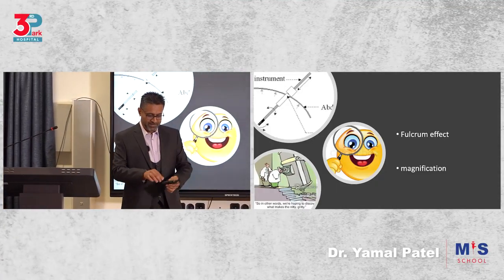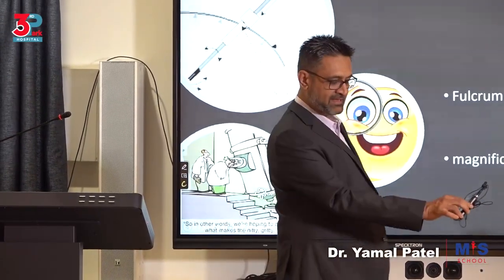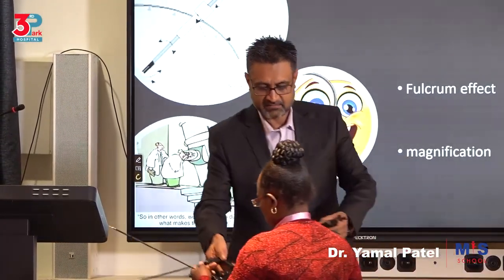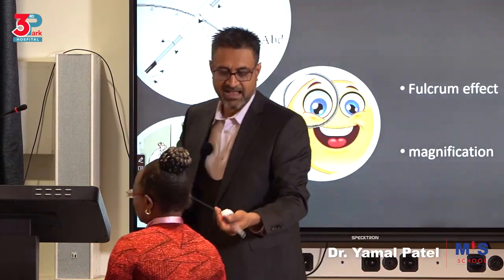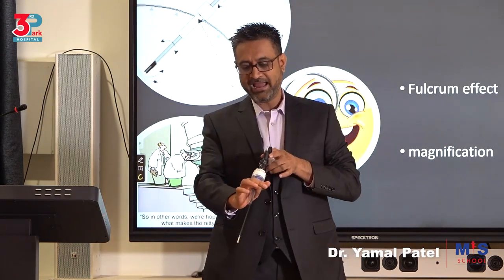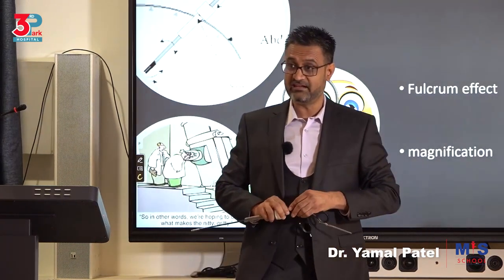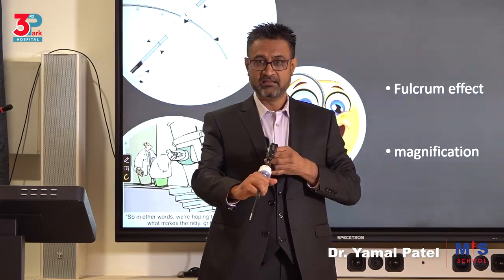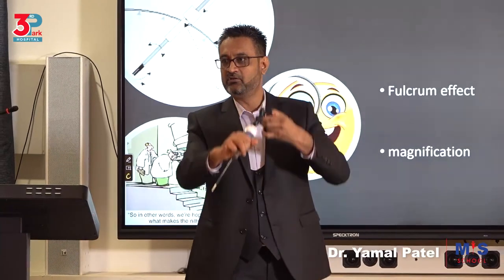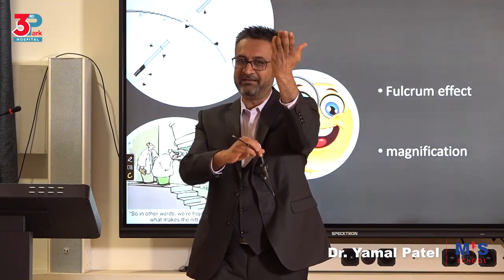Fulcrum effect. When I'm doing an open surgery, if I want to move this from here to here, I have to move it like that. Okay, the same direction. In laparoscopy, I have a fulcrum at the abdomen cavity. So this is on the abdomen. If I want to move it up, my hand cannot, because you'll realize that's something you might start doing. Everybody initially does that. I tell my assistant, move the uterus up, and the hand goes up immediately, because that's what they want to do. But actually, it has to go down to move the uterus up. You understand what I'm saying?